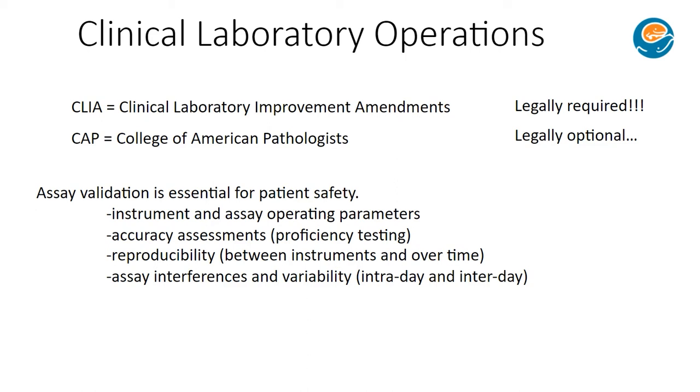And so with all of that as a backdrop, when Dr. Shao reached out to me about his new dialysis device, his question was really around our sensitivity and our accuracy, whether or not we could measure free amino acids in samples before his device and then on the backside of his device, the dialysate, to get a sense of how many of the amino acids were being pulled out inappropriately.